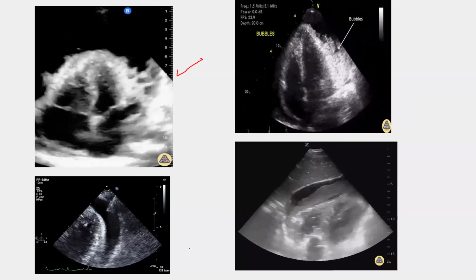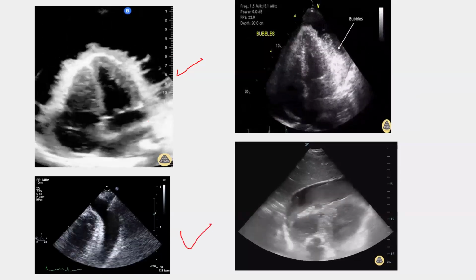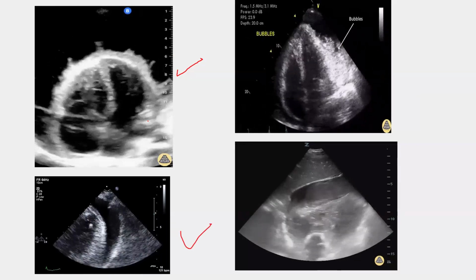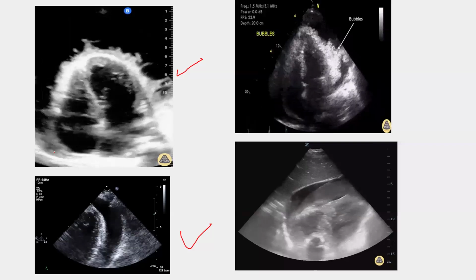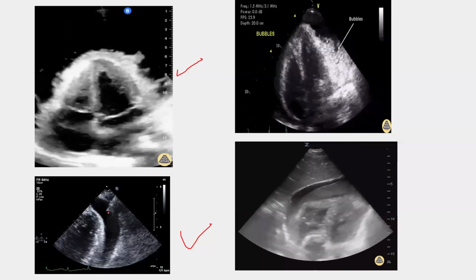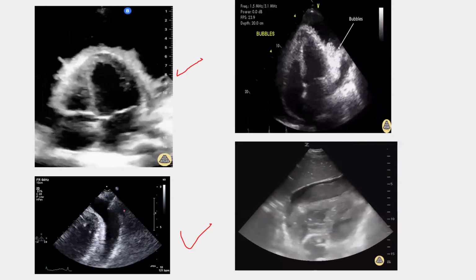What is this here? What are you seeing? What we are seeing here is the needle coming through. Yes, and this is echo-guided pericardiocentesis.